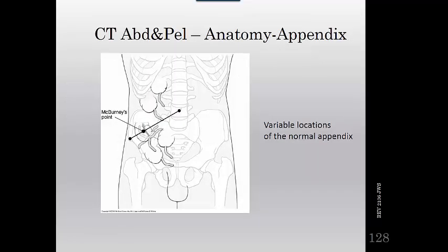Scanning and protocols, but an interesting table of research studies is located in table 21.6, and you take a look at that. It's where several different prep protocols were examined, and of them, one is of particular interest because you're going to encounter this numerous times in your career. A CT protocol has also been advocated that includes the entire abdomen and pelvis but does not incorporate any contrast agents. This examination can typically be performed in 10 minutes or less and does not expose the patient to the potential risk of IV contrast and requires no bowel prep.